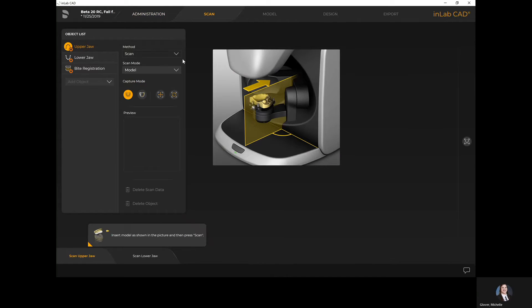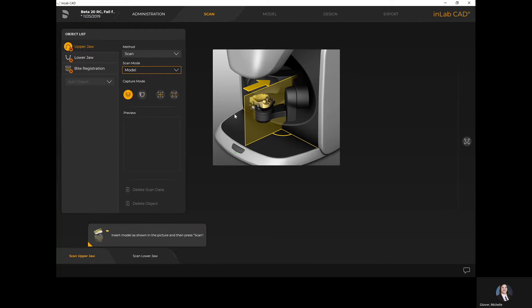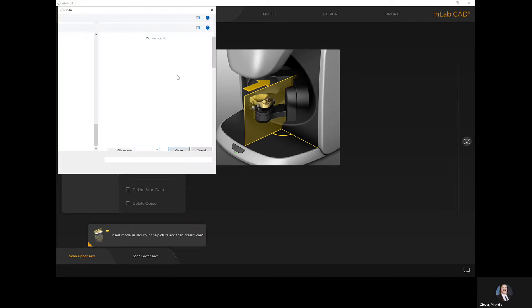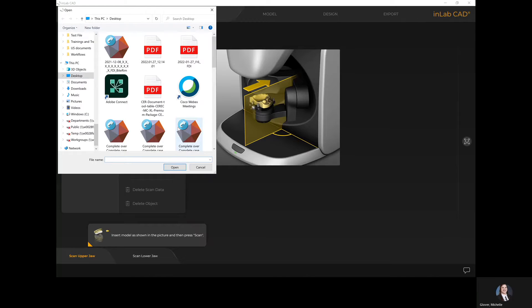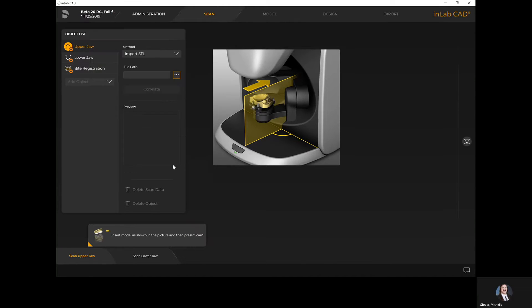In the scan step, if you are connected to an INEOS X5 scanner the method will default to scan, where you can scan either a model or impression. However, if you are importing an STL file, you'll need to change the method from scan to import STL so the software knows it's going to import a file. Here I've changed it to import STL and I'll select these three dots to find my STL files to import into my arch.